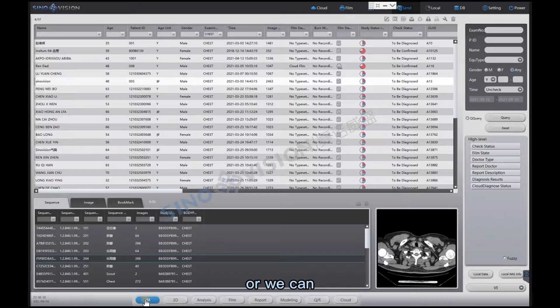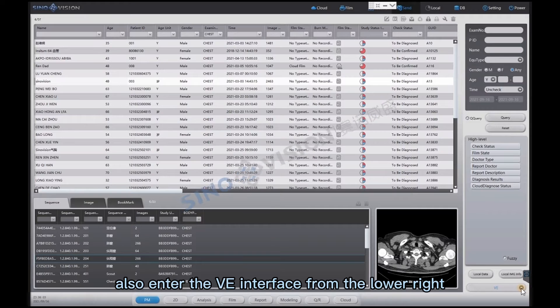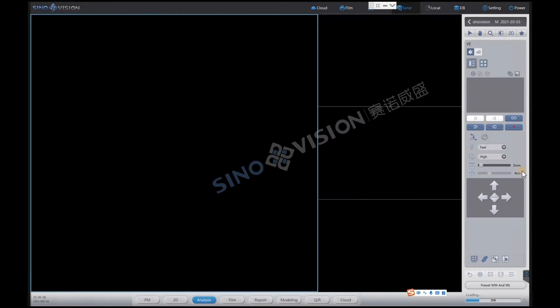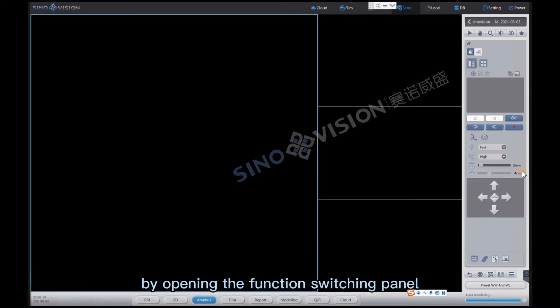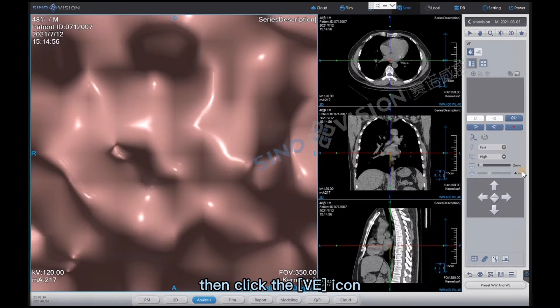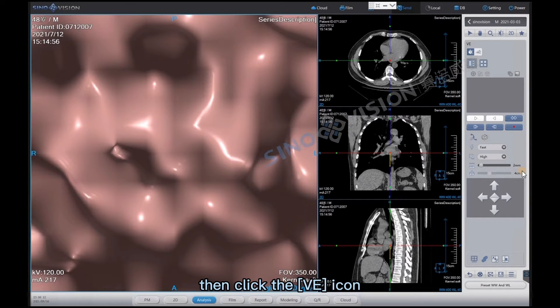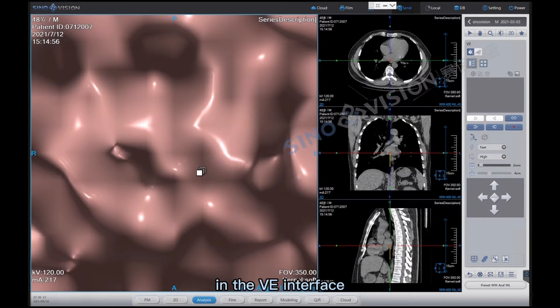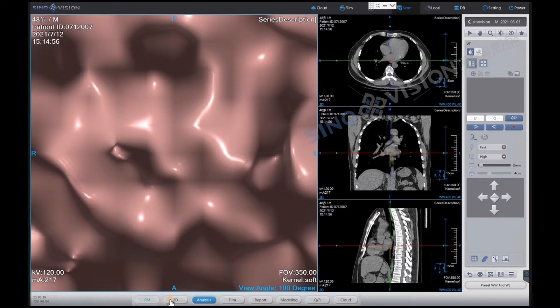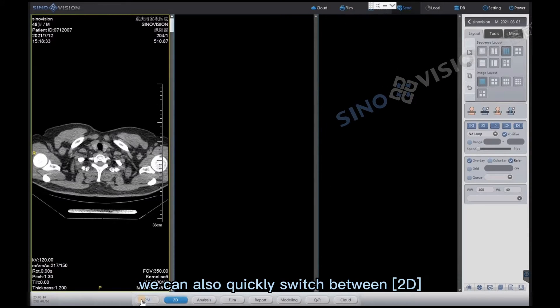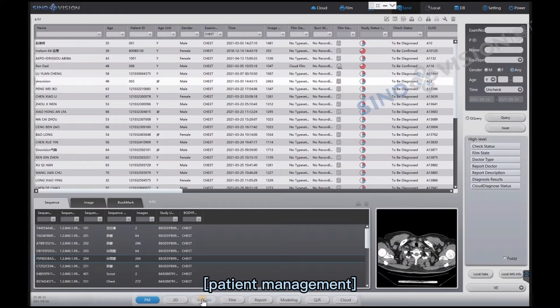Or we can also enter the VE interface from the lower right corner of the screen by opening the function switching panel, then click the VE icon. In the VE interface we can also quickly switch between 2D, VE, and patient management.